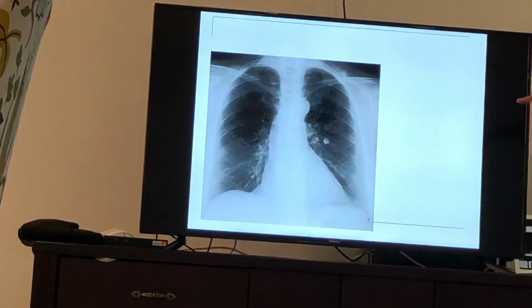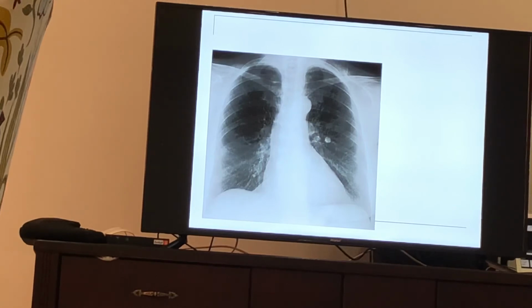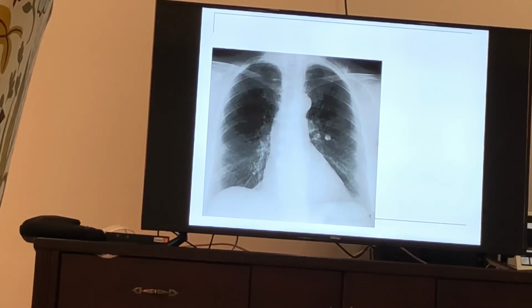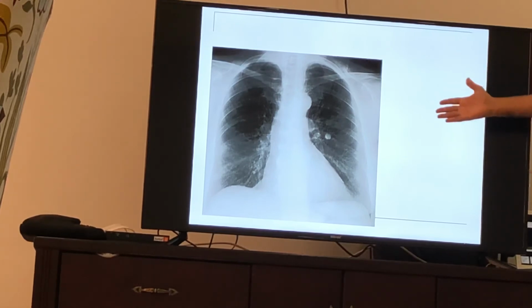There's a shadow down there. If it was me, it looks like a double diaphragm. I would put diaphragmatic hernia top of the list here, but you won't be able to confirm except with CT imaging. Most people come to us with abnormal X-rays, even pre-ops, unfortunately. With whatever suspicion you have, you have to do CT imaging. Usually they do CT, we diagnose it, and there's nothing to be done; most live with it. There are two types of diaphragmatic hernia, Morgagni and Bochdalek, ventral and dorsal, but most patients are asymptomatic.